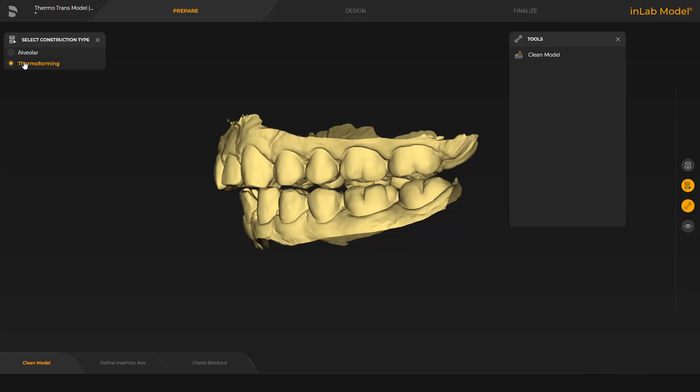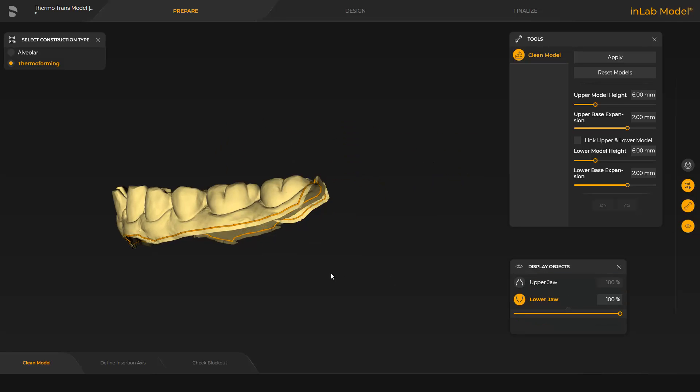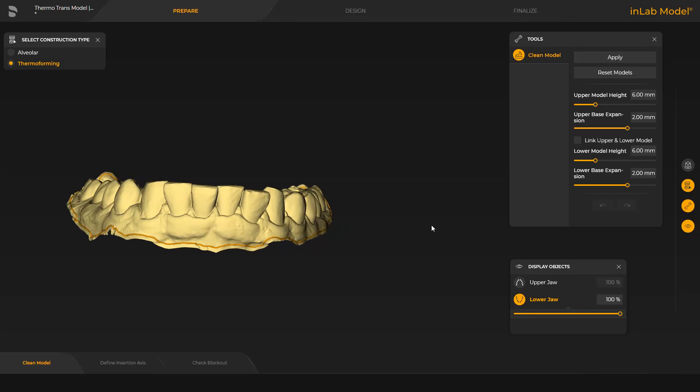This change reveals further steps in the Step menu. However, in this step, we begin with the Clean model tool. We will demonstrate how this tool works with the lower jaw and therefore hide the upper jaw for now. We begin with a double click at any point of the line and keep placing single clicks until we reach a point where we finish the modification with a double click.